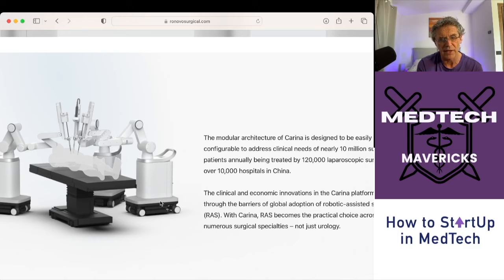You can bring these carts in at any angle you want to the table, which is very reminiscent of a Medtronic Hugo. But it's very different to the Hugo in pure dimensions — anyone who's seen the Medtronic Hugo will know they've got very large bedside carts. The Carina carts look more like the dimensions of something like a Versius, so you've basically got a small compact bedside unit. There are some things that are good about a Z-rail, and some things that are going to be challenging around a bed on a modular system.